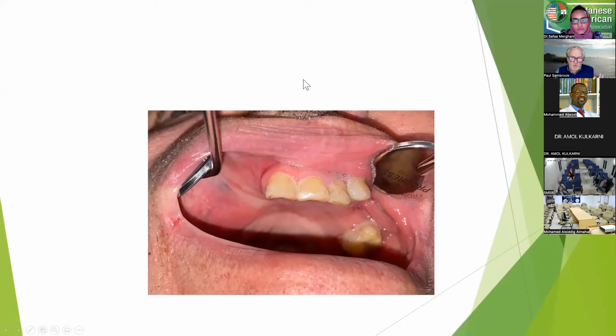So virtual surgical planning in oncology gives us the opportunity to do a much better and fairer reconstruction for our patients, really trying to give us a good opportunity to reconstruct their entire masticatory apparatus, breathing, eating, and speaking, and hopefully improve the quality of life that these patients have for the rest of their life.